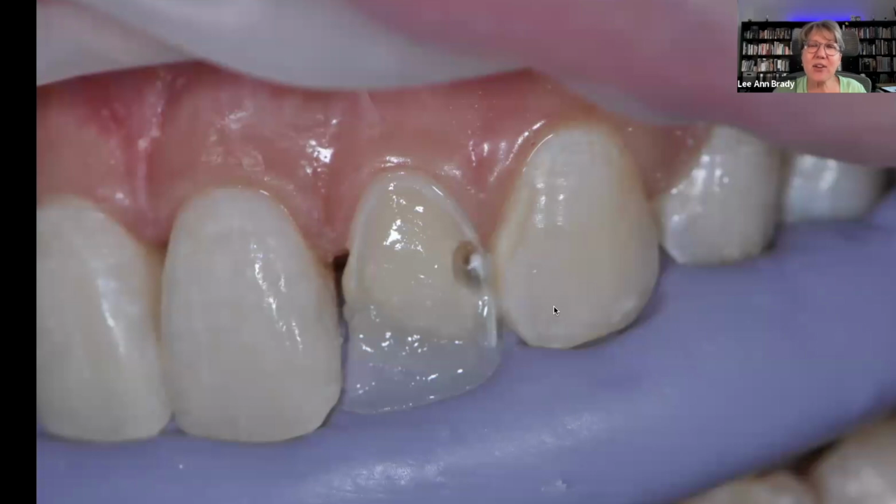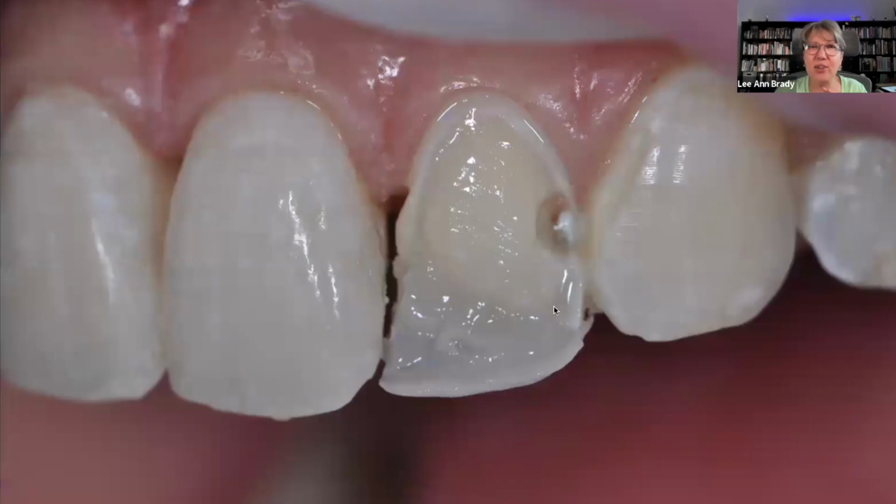And it's the layer that's chosen for its opacity, its light reflection, and now it's going to bounce light to help me create the appearance, the value of the natural tooth. And again, I've stayed away from the actual contacts. I haven't built up the contacts or the interproximal because I want to do that with a translucent enamel based composite. And also, you need to put mylar strips in there, and we need to actually make contacts.